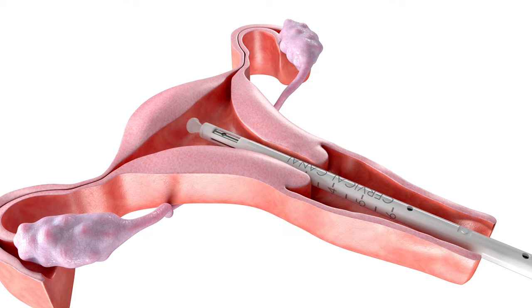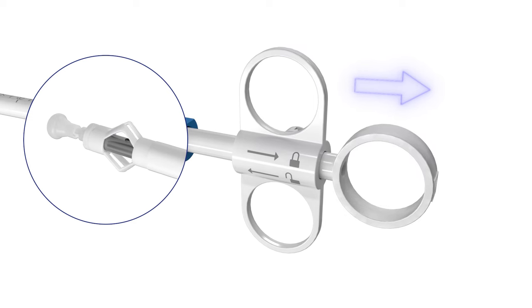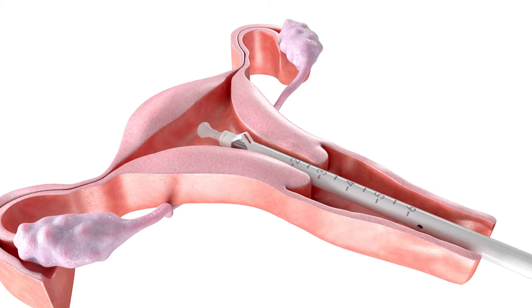insert the SureSound Plus device transcervically past the internal os until the distal tip is in the uterine cavity. Once inside the cavity, squeeze the finger and thumb rings together to deploy and lock the malacot. Pull the device back towards the internal os until the malacot meets resistance at the internal os.